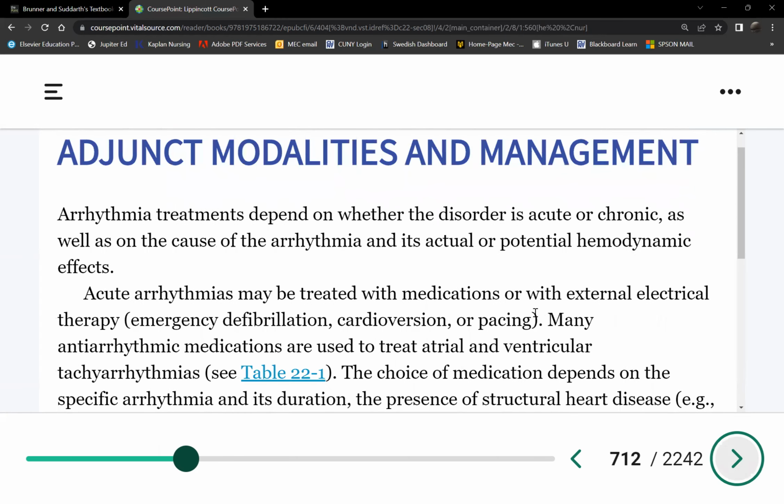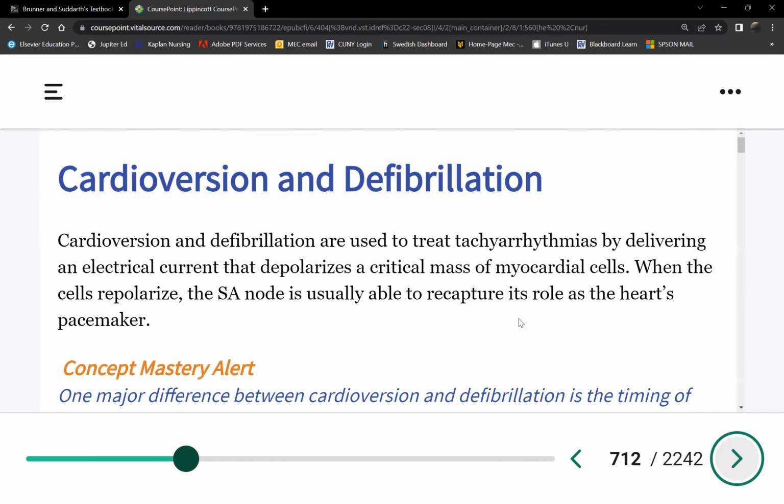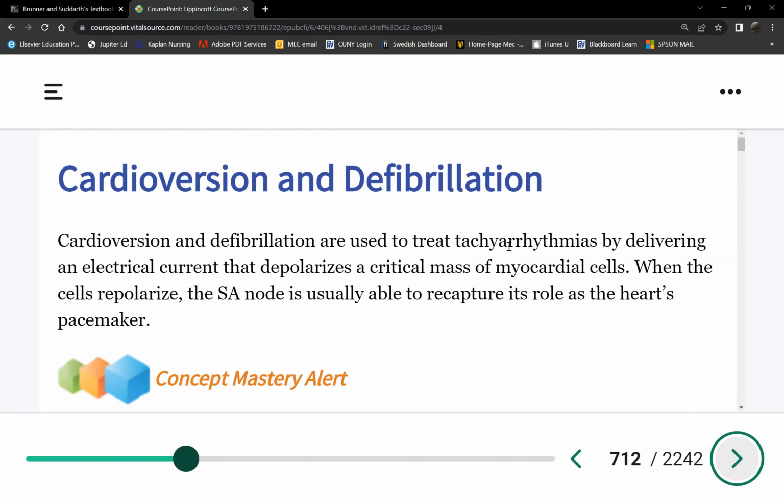So the next few pages, we will deal with your responsibilities about patients who have pacemakers and defibrillators, particularly implanted cardiac defibrillators. Okay. Cardioversion comes up first, so let's compare again, cardioversion and defibrillation. If you remember my quick description last week, what's the difference between these two? Is the machine different? No. Same machine. What's gonna make the defibrillator a cardioverter? Synchronized button. What's the difference between the two? When is the electrical shock given?